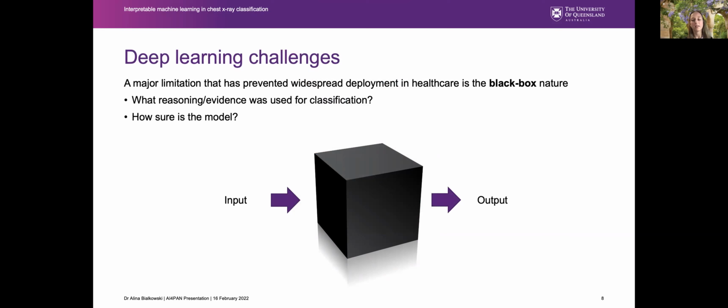deep learning methods. So artificial intelligence is a broad term that encapsulates any kind of computer-based method that has some kind of signs of intelligence or can fool humans into believing so. But a big component of that these days is something called deep learning. So deep learning is effectively this massive black box where you feed in some input.